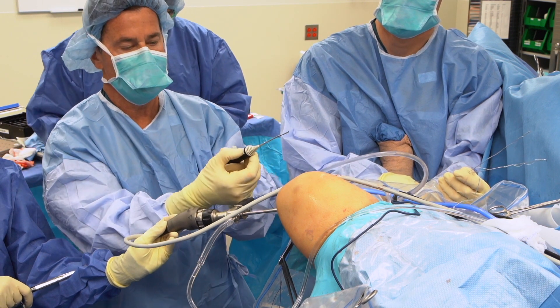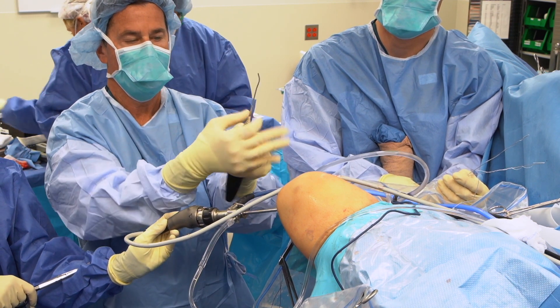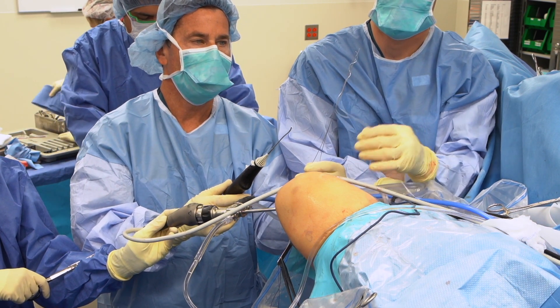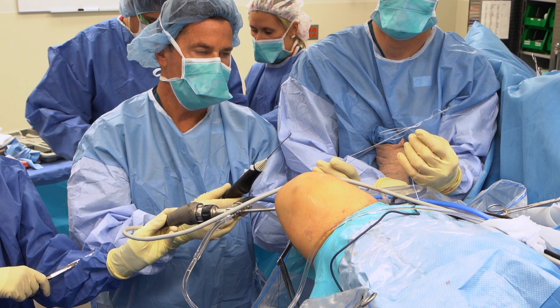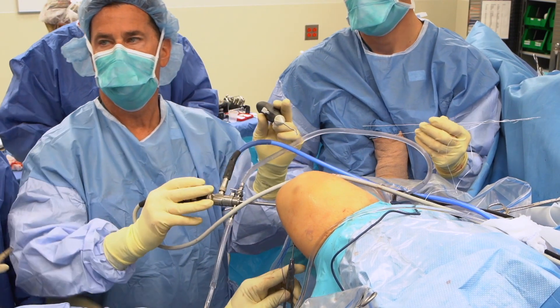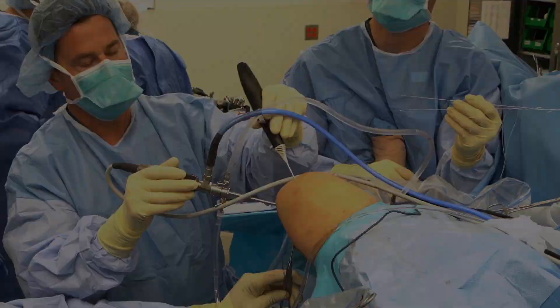You can adjust the position of the needle by the trigger right here. This will allow us to put it in and take it out, or swing it any direction we want. The needles themselves are swedged on with .9 millimeter suture tape, and tape is good because of the interference it has with the meniscus to the periphery. So we can eliminate essentially an assistant almost just by introducing and advancing the needle safely.